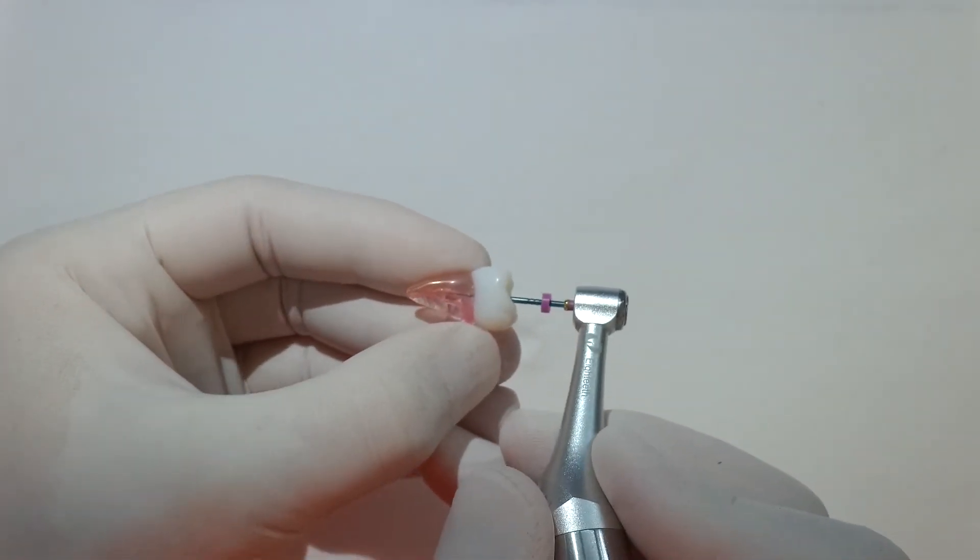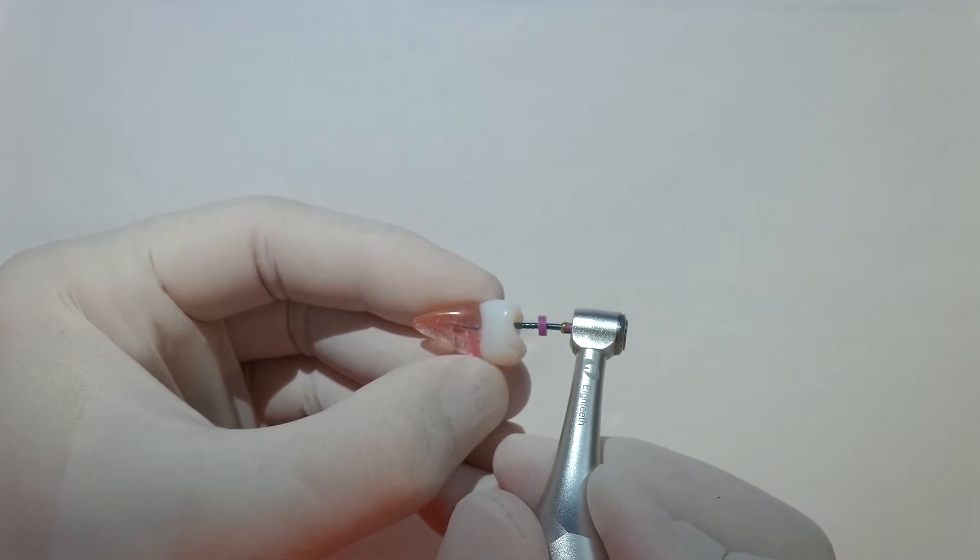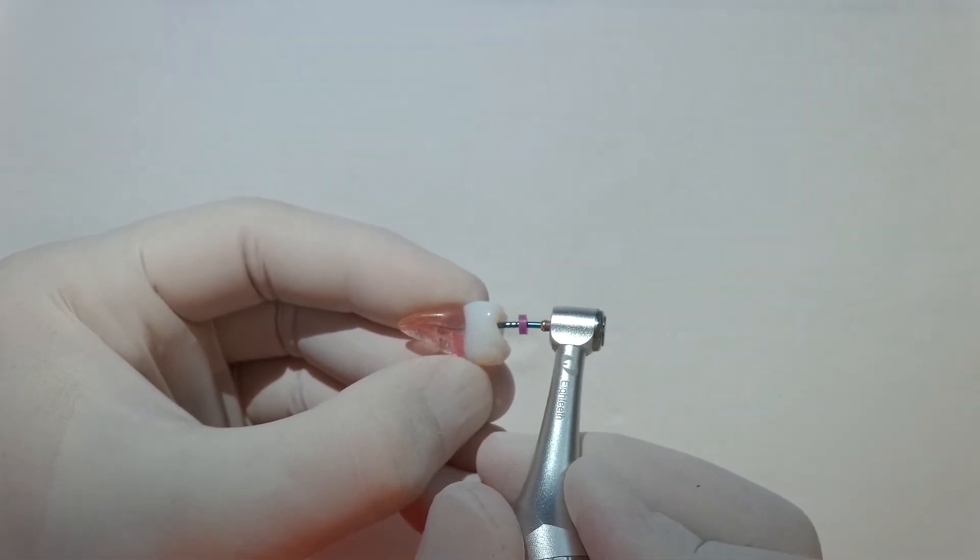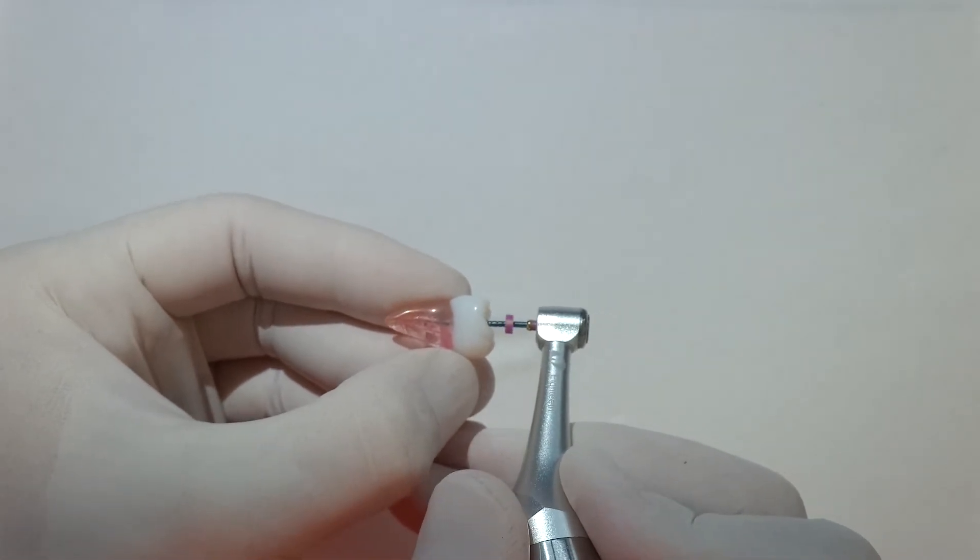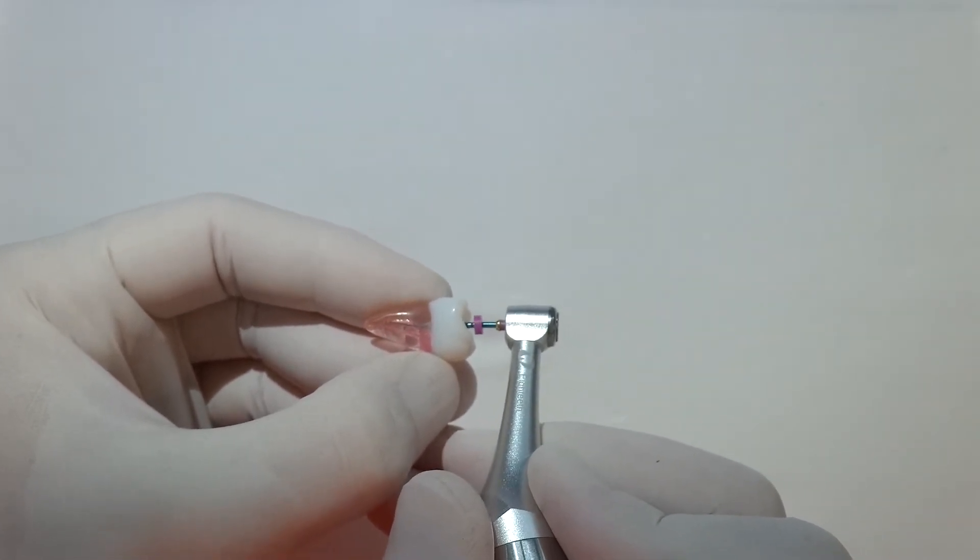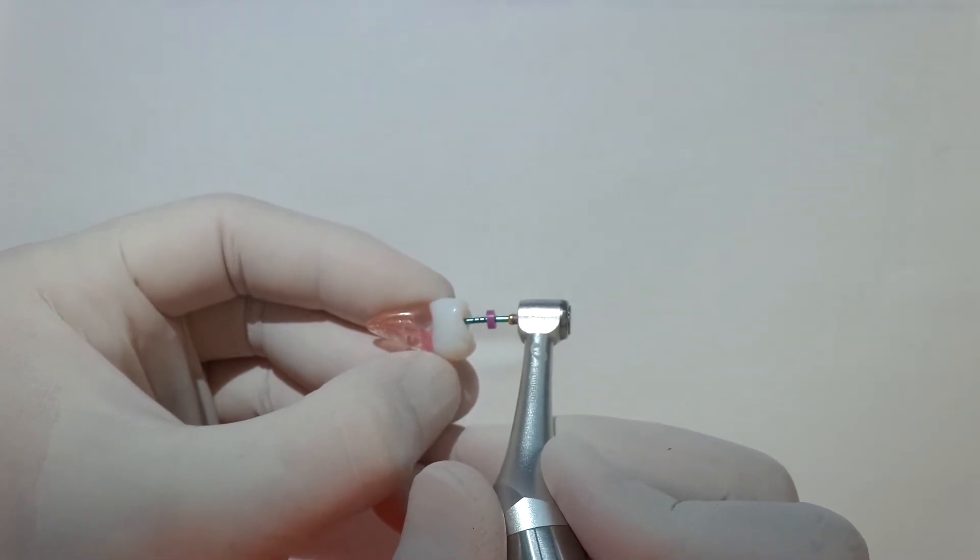Gradually introduce our S1 file. This is mainly to do the coronal flare. The apical part of the file is just guiding, and that just ensures it stays centered in the canal. Then we can just brush on the outward stroke until we reach our working length.